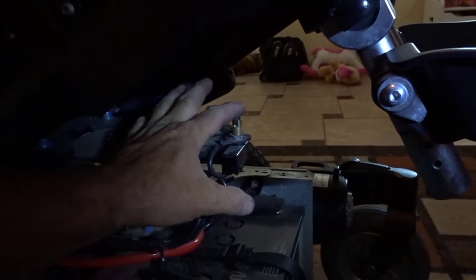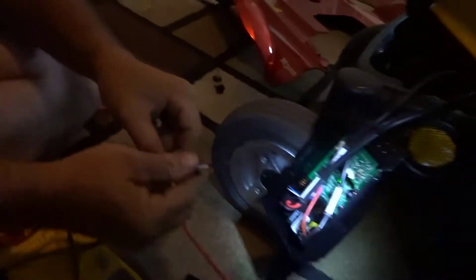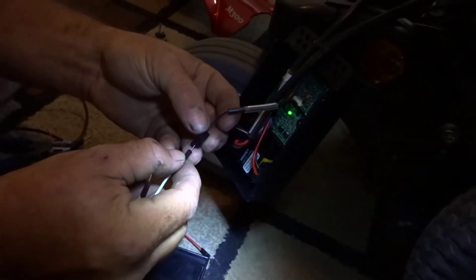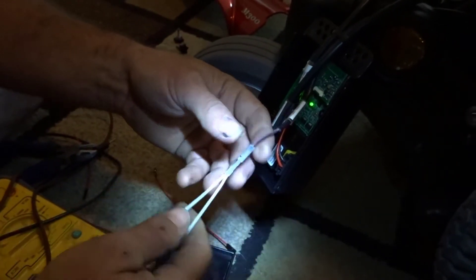We got into it today and here indeed is an end switch. We've traced the wire to where it plugs into the circuit board right here. I've got my continuity meter out and I'm going to plug this into the female connector — there's a male and a female.